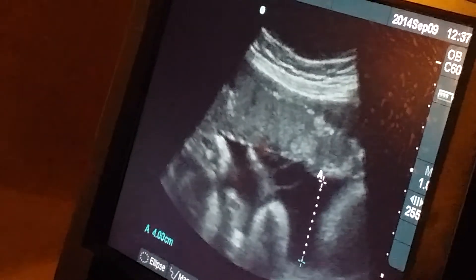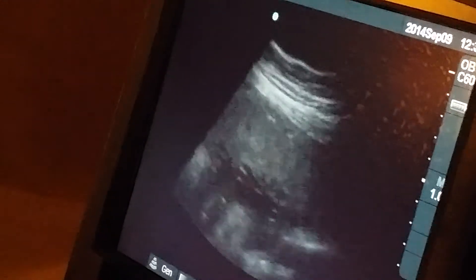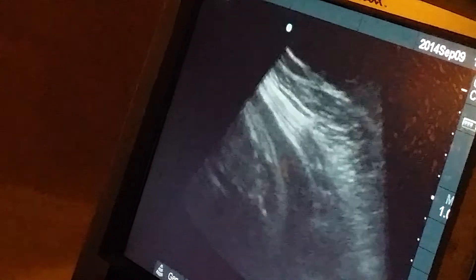The fluid looks perfect. Let me just look around, make sure I got the biggest pocket there. Looks great. Okay, let's turn that off.